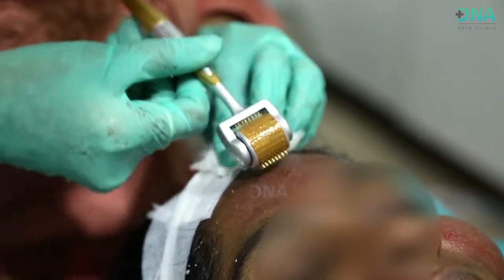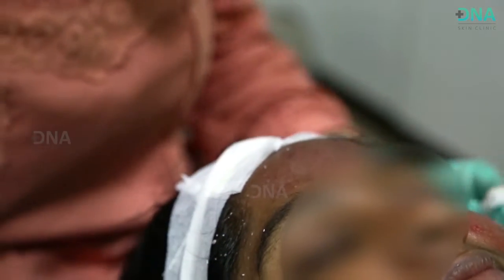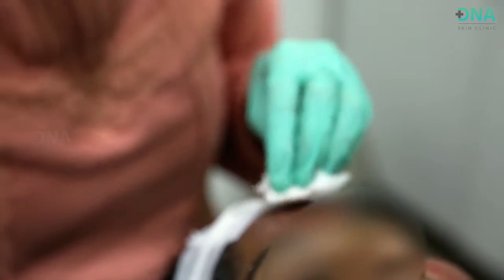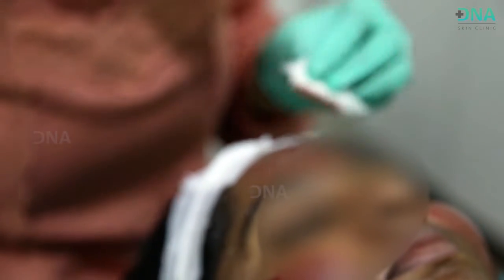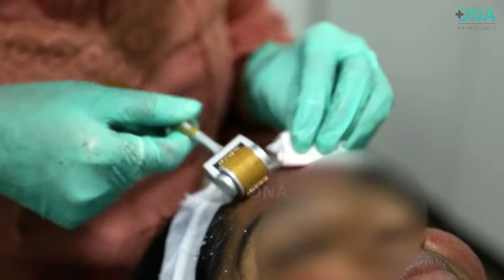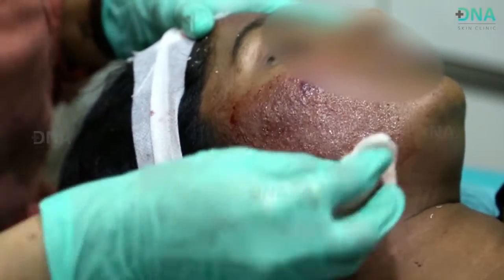Very superficial here, and I will also not be giving too many strokes on the forehead because she doesn't have a lot of acne scarring on the forehead. It's more of acne pigmentation that she has, and also uneven skin tone, but there are not many scars, so I am not giving a lot of strokes on the forehead. And then we clean the treated area with normal saline.